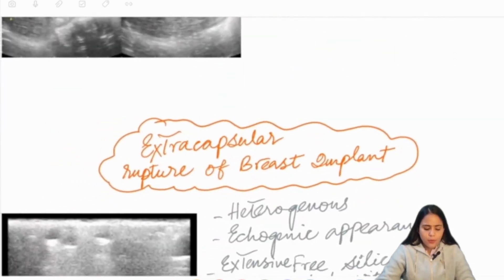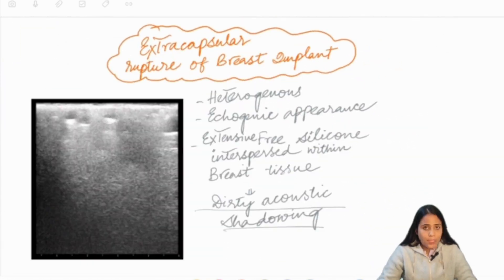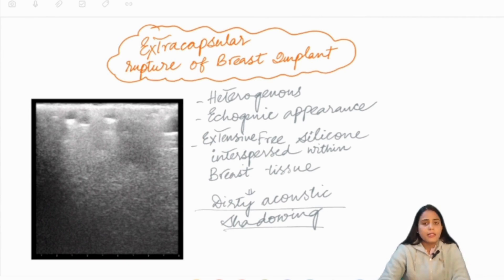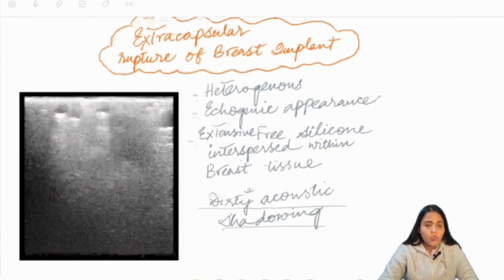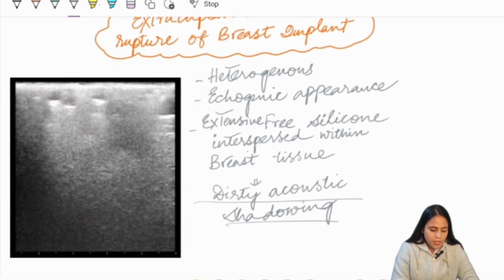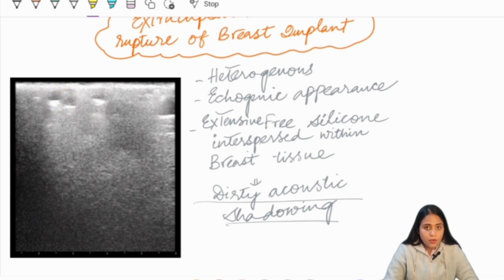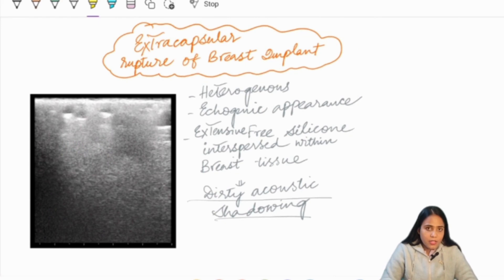Next is extracapsular rupture of the breast implant. Breast implants are made up of silicone, and in extracapsular rupture these silicone particles are now free — freely interspersed throughout the breast parenchyma. They give rise to this heterogeneous echogenic appearance, as you can see here. These are all free silicone particles which produce dirty acoustic shadowing behind them. This is the snowstorm appearance of an extracapsular rupture of a breast implant.